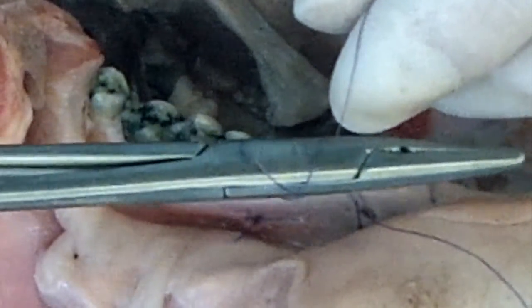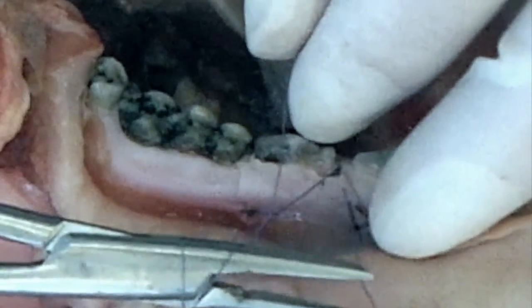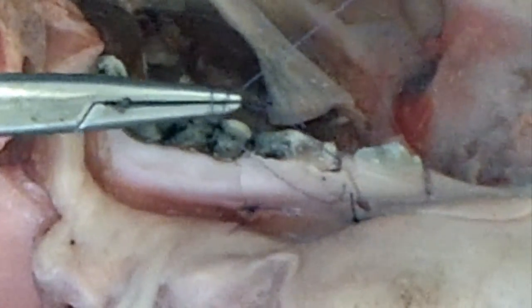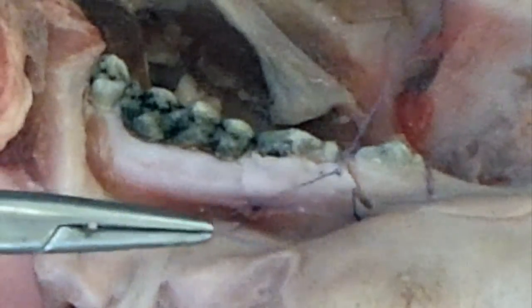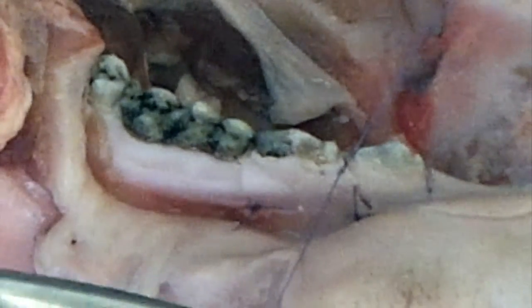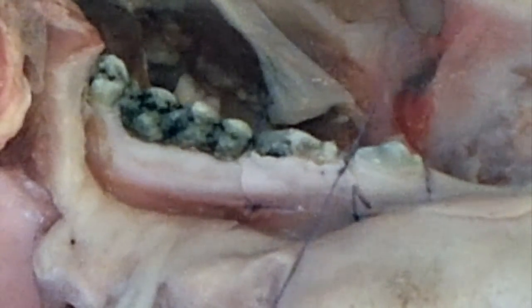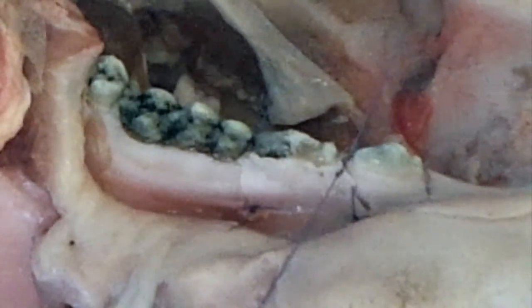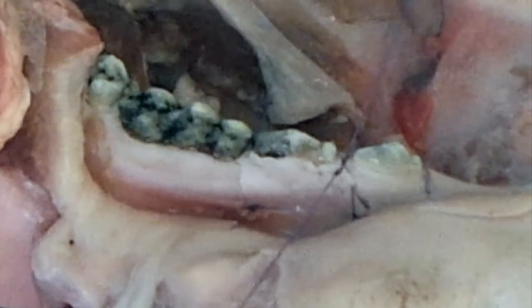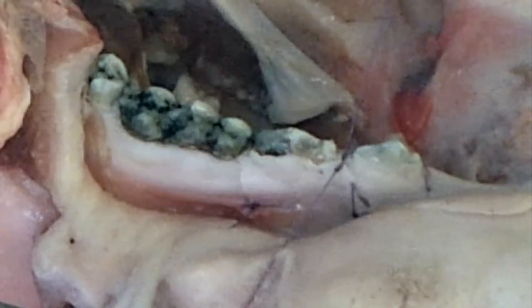Я просто так ушиваю — два витка. Это никакая не рекомендация, просто мне так удобно, поскольку нити, которыми я пользуюсь, достаточно тонкие и требуют более прочной фиксации. Одного узла мне кажется недостаточным.